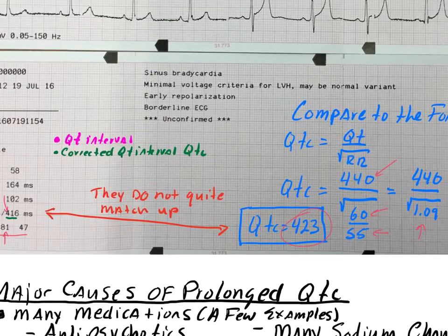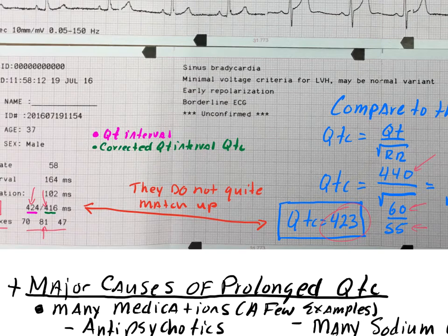And then I compared it to what we got here, and you can see there's a little difference, huh? Okay, they don't quite match up. All right. And again, this pink color here is what the computer calculated as the actual versus the corrected here. There is a little difference.